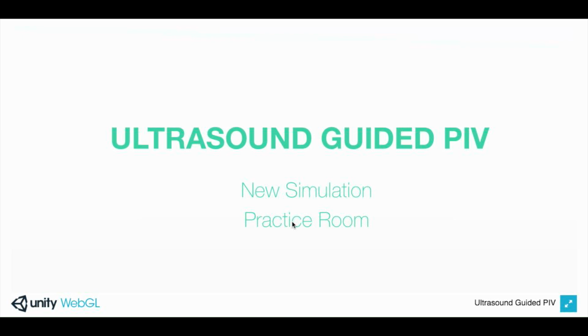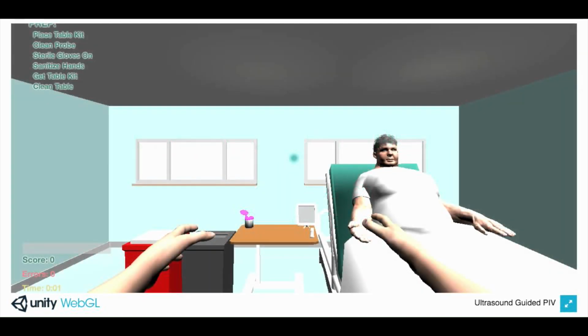I know you're excited to get started, but you've got to learn to walk, literally, before you can start performing simulated ultrasound-guided PIVs. Let's step into our practice room and review a few basics about how to operate the program before you start placing ultrasound-guided PIVs. As you can see, the screen is presented from your direct line of vision. The hands you are looking at are yours.